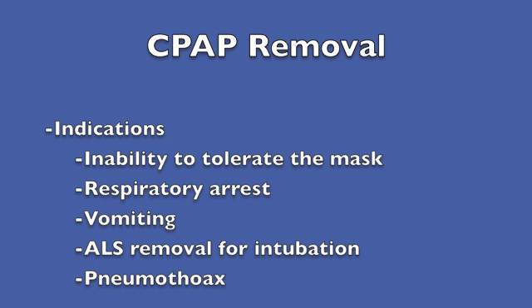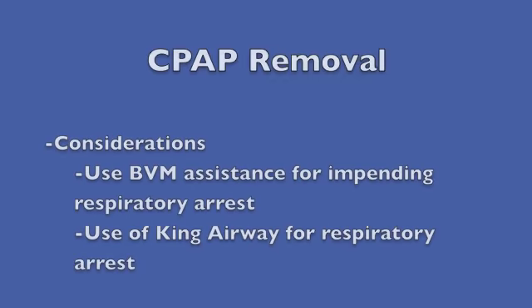CPAP should be removed for the following indications. The patient is unable to tolerate the mask. If there is respiratory arrest. If the patient is vomiting. If the mask needs to be removed for intubation by ALS or pneumothorax.